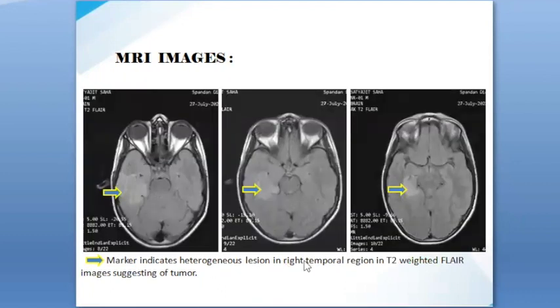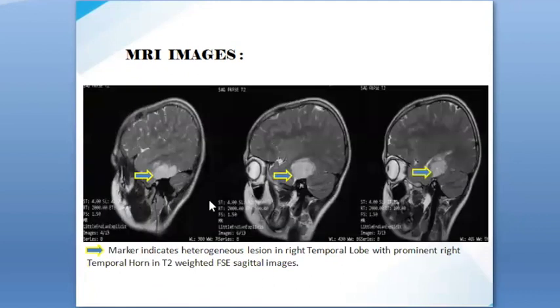The T2-weighted FLAIR images also indicate the tumor, showing a hyperintense or heterogeneous hyperintense area in the temporal lobe, consistent with tumor. Here in the sagittal plane, the T2-weighted sagittal images also allow us to locate the tumor.